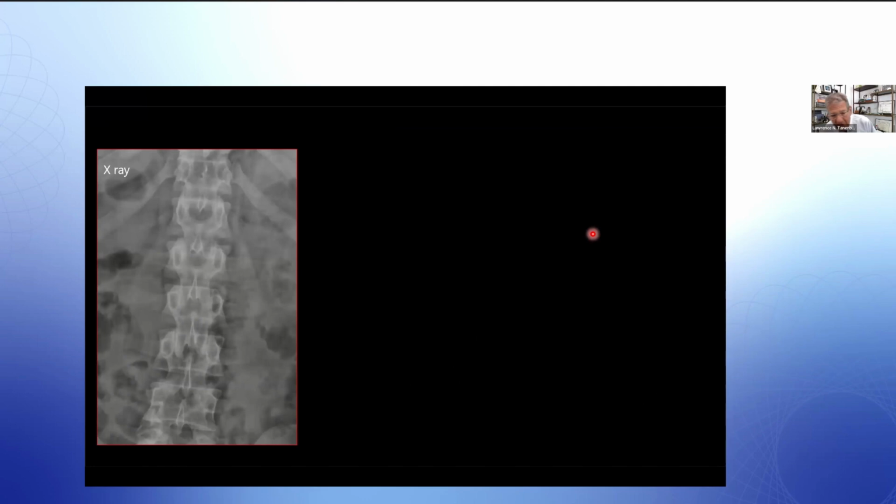All right, so here's another case, and here we're in the spine. Patient presents with acute back pain. You do the x-ray. It's a gorgeous looking exam. Hard to see that there's anything wrong here. You might call it normal. You might ask the patient to come back in a few weeks if they don't feel better.